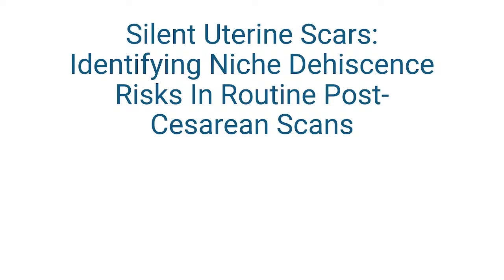Have you ever heard about them, or have you ever come across such where you have got complications related to cesarean sections, or you overlook them? So let's have this conversation.